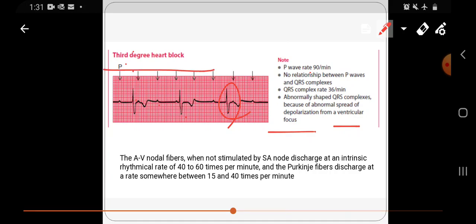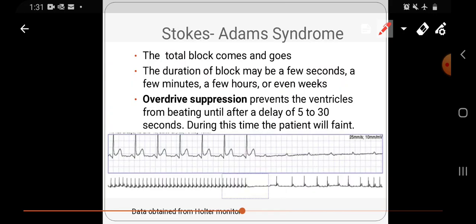فإذا this is third degree heart block. إحنا بدأنا بالfirst degree إنه بس simply إنها PR interval is prolonged. second degree PR interval is prolonged بحيث إنه sometimes the signal does not pass. وبالthird degree اللي بيصير هو إنه none of the signals pass. فبالتالي إنه ventricles they have to create their own rhythm. They are on their own now. والرhythm يا إما بيجي من البندل و more commonly إنه يجي من ال Purkinje fibers. أوكي كيف بنميز هون؟ إنه زي ما حكينا ال P waves has no relationship to the QRS complexes وفي عنا two rates. ال atrial rate is much higher than the ventricular rate. Okay.